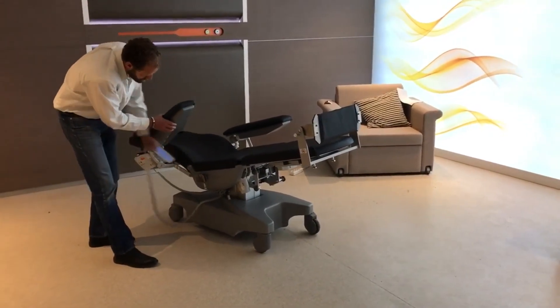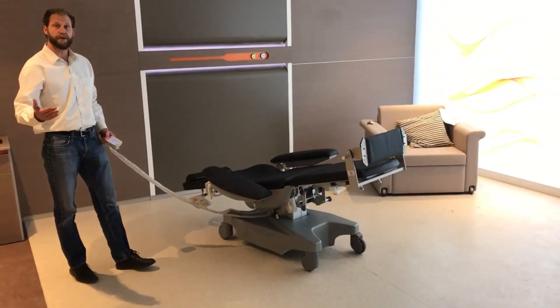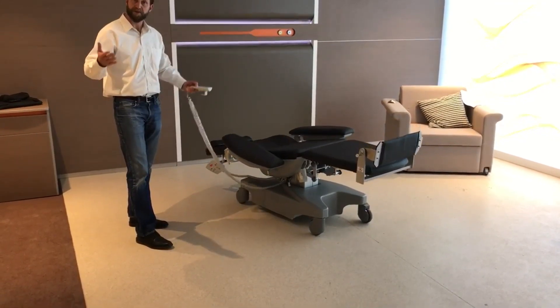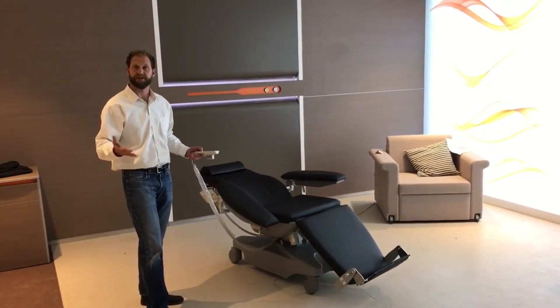The side rail component simply slips right into our notch on the side. Weight scale is also an option, so if you would like a weight scale please look at our website videos for the weight scale. The weight scale comes in kilograms and pounds, and offers some safe entry features as well as entry and exit features.